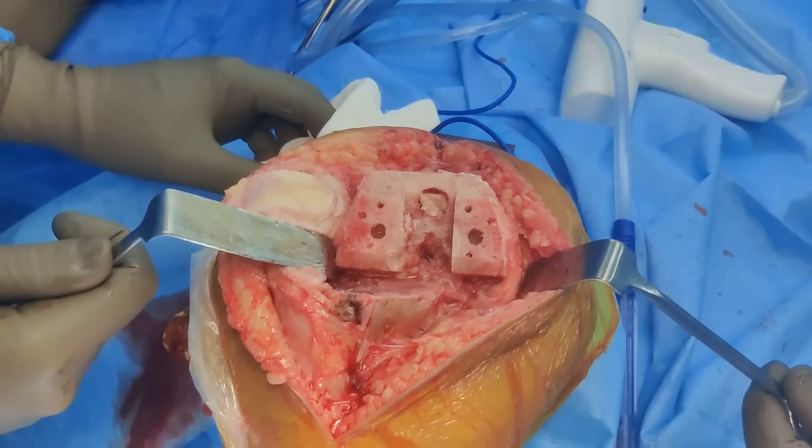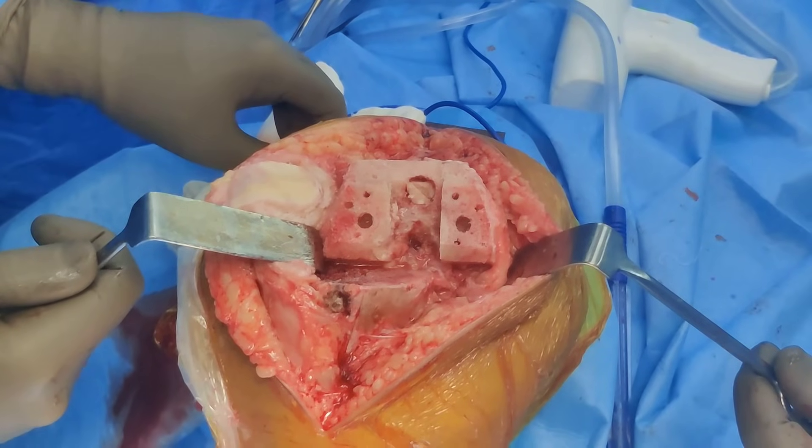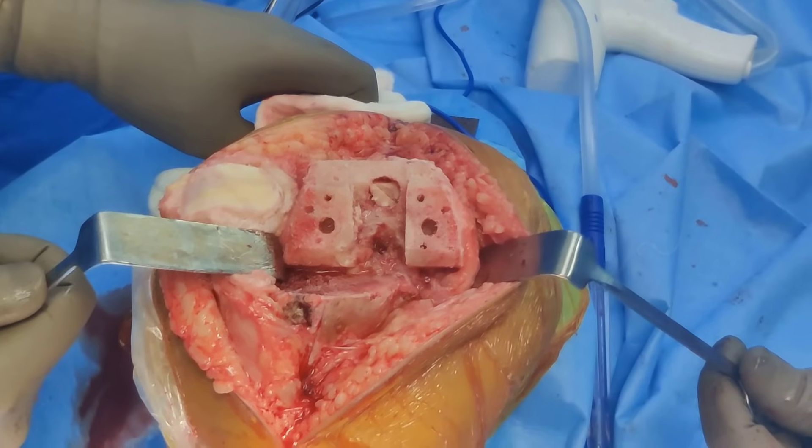This is my way of doing sawing for knee replacement — not just because I do it this way, but because I have been observing various good surgeons across the world and built this practice. The key principles are: use the saw at full speed, make sure the blade doesn't bend, use the correct saw direction for different cuts, place retractors properly, and appreciate how deep to take the saw — especially for the posterior femur cut and tibial cut — to avoid catastrophic events.